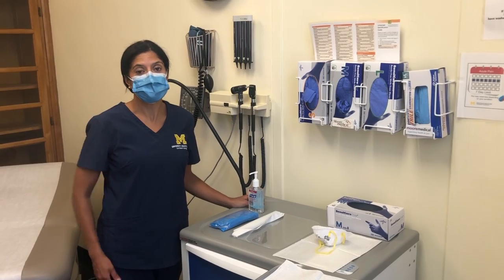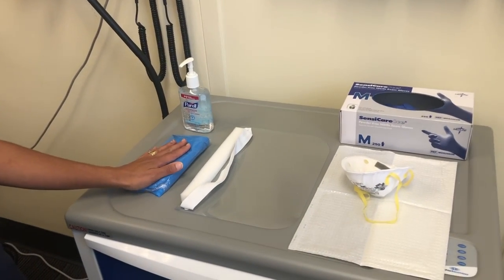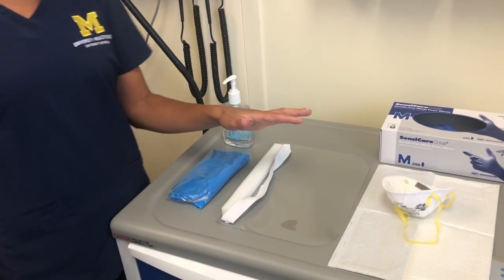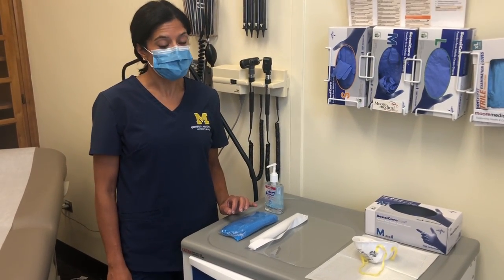First, you want to identify the equipment that you'll need, like your PPE. You can see here we have hand sanitizer, we have a gown, a face shield, a face mask, and gloves. You're going to want to use an N95 if you're swabbing a symptomatic patient, but if you're swabbing an asymptomatic patient, an ear loop surgical mask is just fine.